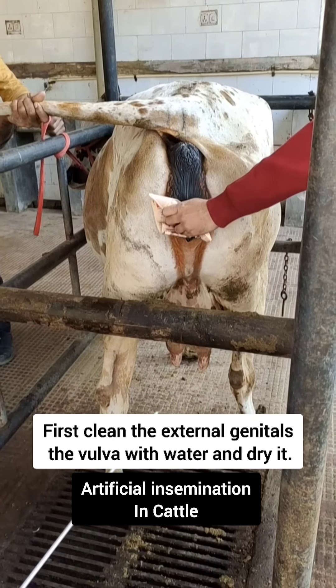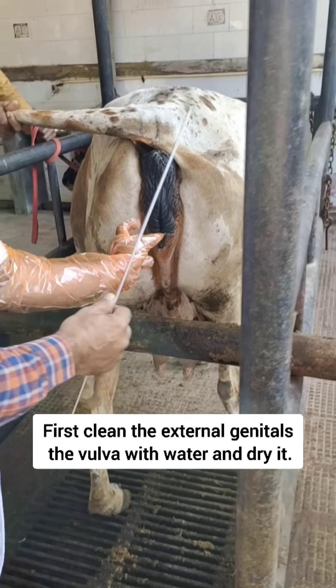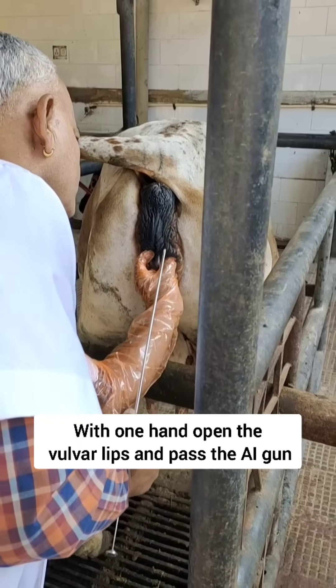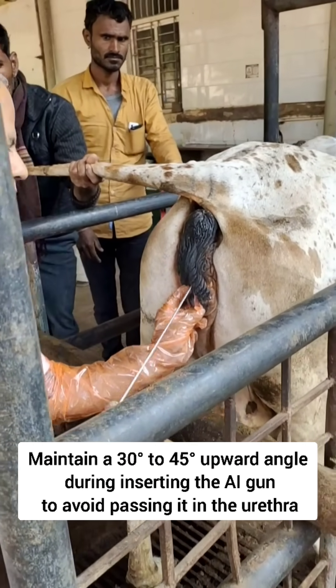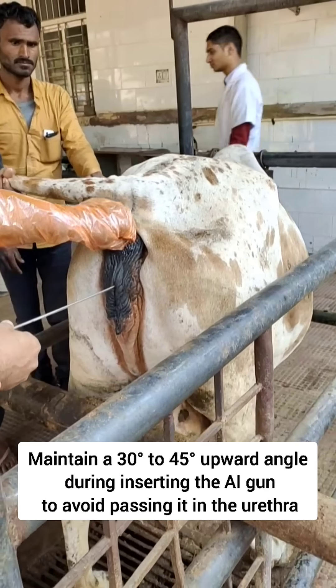For inseminating a cow, first wash the external genitalia and the vulva. Then with your hand open the vulva lips and push the AI gun at a 30 to 45 degree angle, and then straighten it.